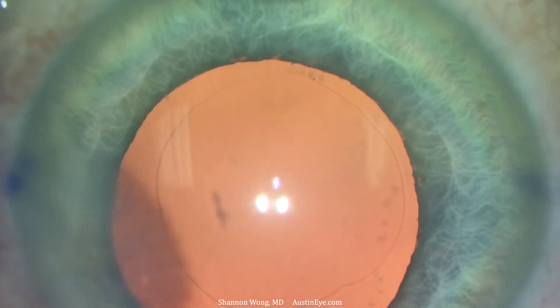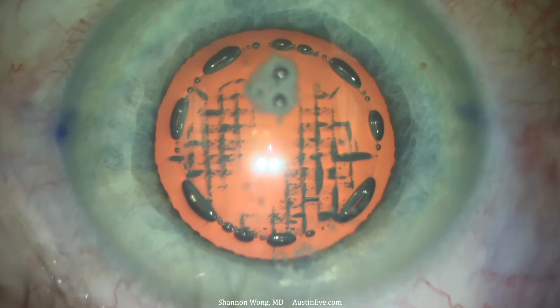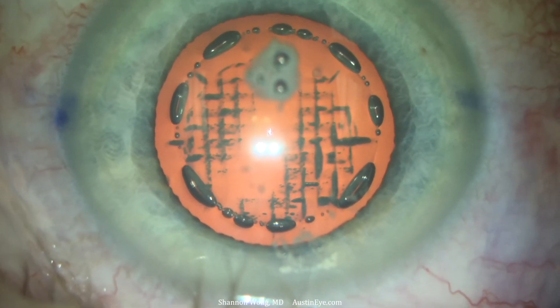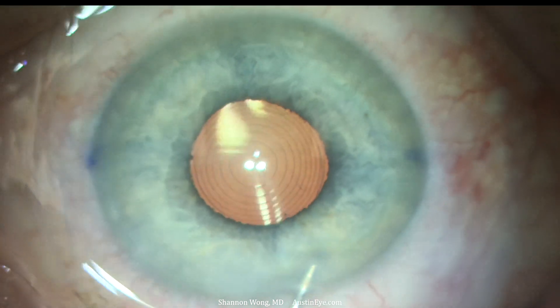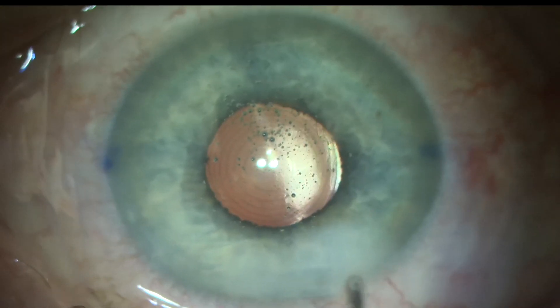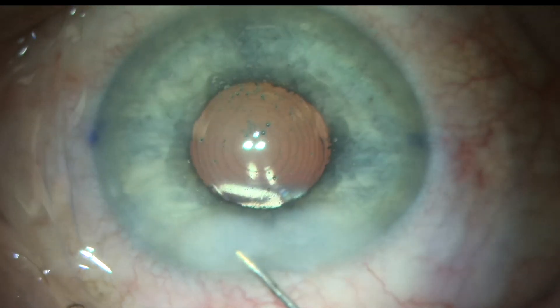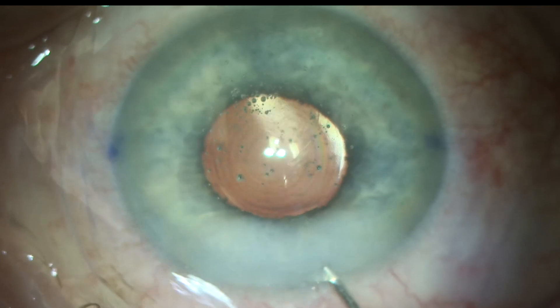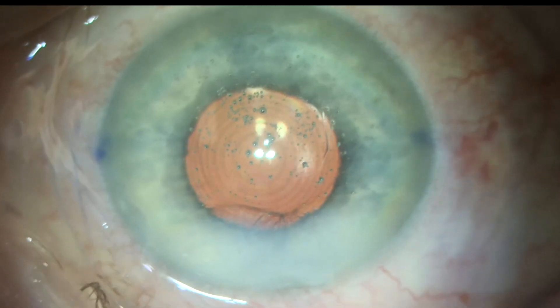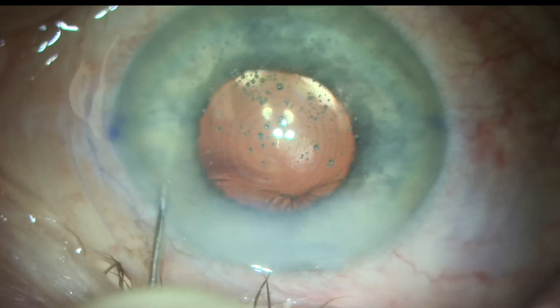So the take-home message: when you see this pattern, don't be fooled. Proceed with caution. The rest of the procedure went well. We placed the Symfony toric lens and the patient saw great the next day. I hope you found this video useful and can learn from this situation should you encounter it in the future. Thank you for your time — have a wonderful day.